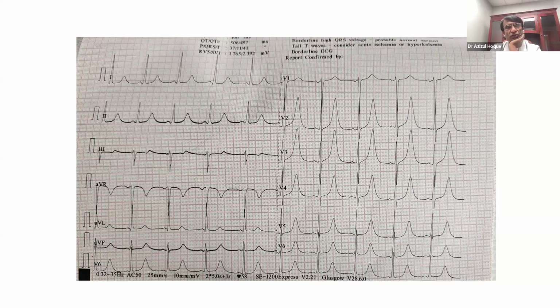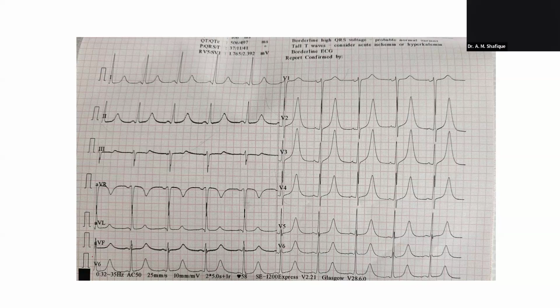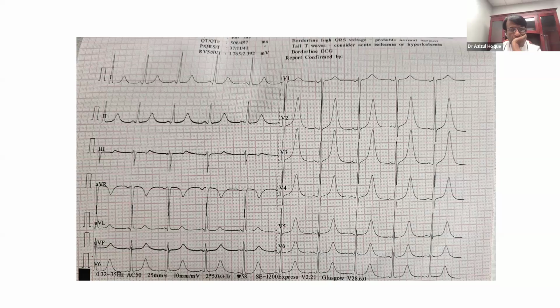The one question right now with this T wave normalization over time: did it correlate with better blood pressure control and volume control? Today blood pressure is 110, 108 by 64, 65, something like that, less than 110 by 70. Today she's on arterial blood pressure monitoring. We did not do the NT-proBNP today again, but her previous NT-proBNP was 25,000 the day before.